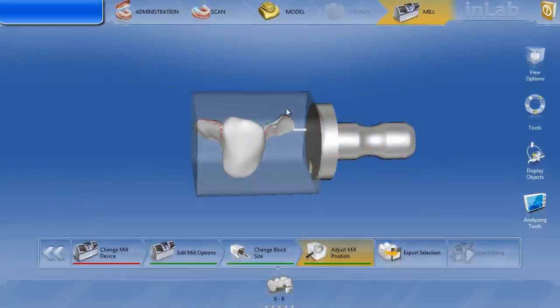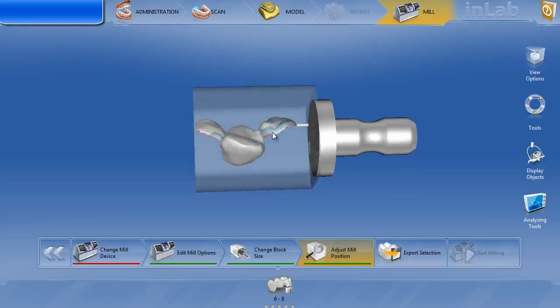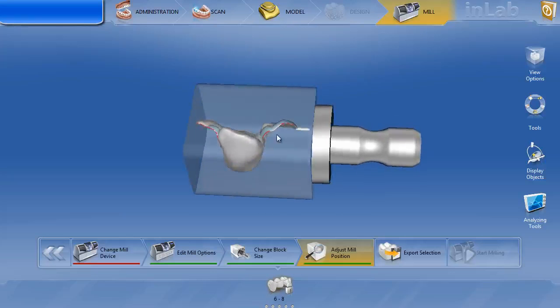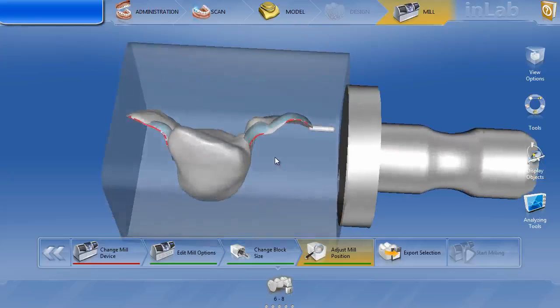This was a case sent in to look at some strategies on how to design a Maryland bridge a little bit easier. This is tooth number six to eight, replacing tooth number seven. The dentist had numerous occasions where she was having trouble with the wings breaking during milling, and when she got the wings to mill, they were binding and pretty difficult to seat. So looking at the mill phase, this is how I got the case.